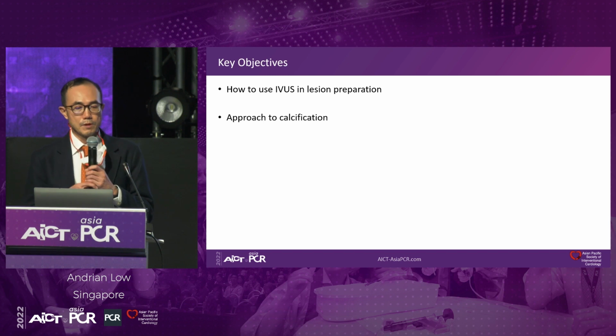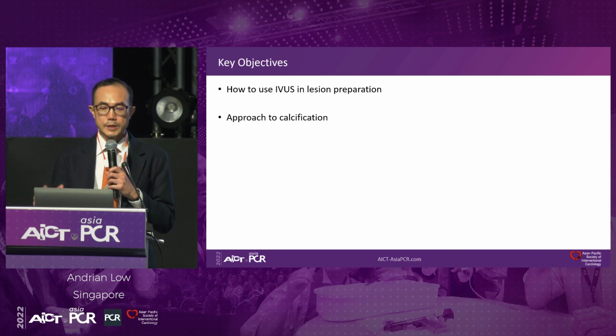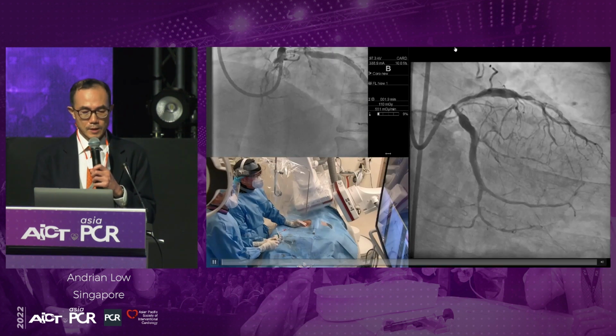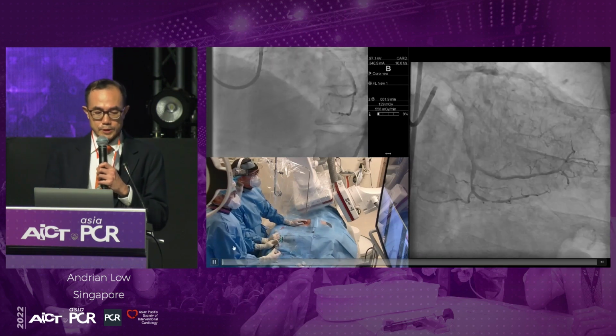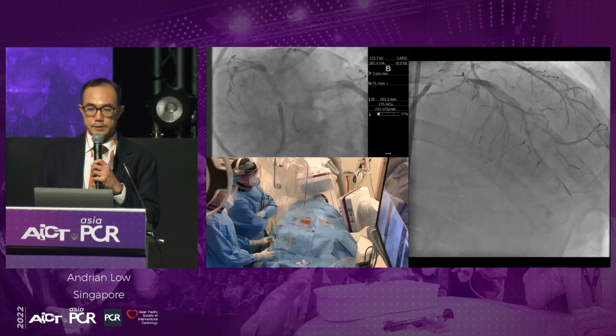Over the next couple of minutes, I will be sharing with you how IVUS might be helpful in gauging the lesion as well as helping you in lesion preparation, as well as an approach to treating calcified lesions, which is increasingly common now. This is the start of the procedure, and I did this procedure with my colleague, Dr. Koo Chie Yang, who unfortunately is not here today.